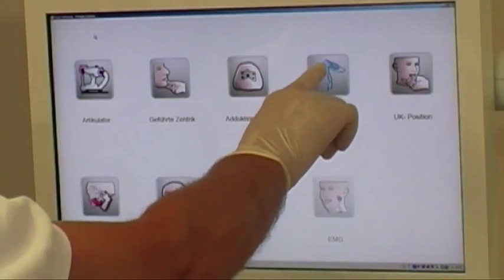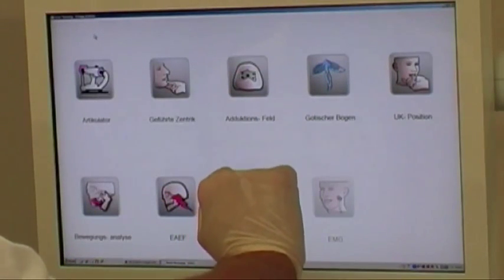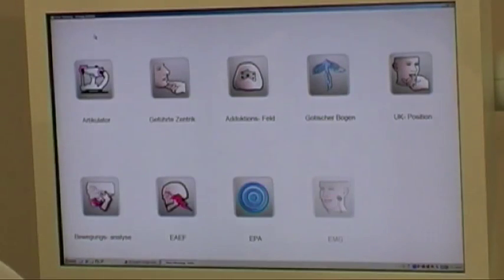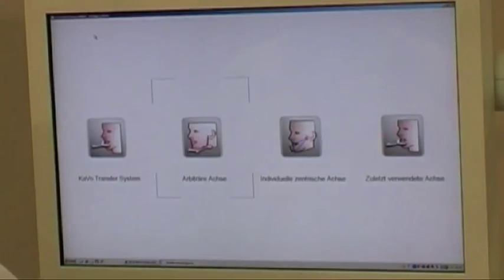After starting the module we have to choose a reference axis. As we will use the centric registration for mounting in the Protar articulator, we choose the CAVO transfer system.